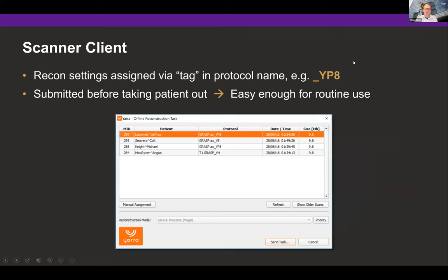Here is how the reconstruction client looks running on the scanner. We add small tags to the sequence names — something like underscore YP8 — and in this way our reconstruction client knows for which scans a reconstruction should be performed and automatically assigns the required reconstruction algorithm. The technicians just have to press the 'Send Task' button and the data is sent away. Typically our technicians do that before taking the patient out of the scanner, and it turned out to be easy enough that they can really do this on a daily basis.